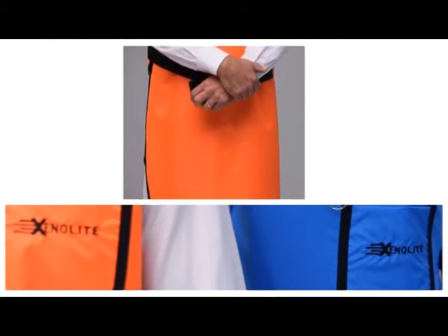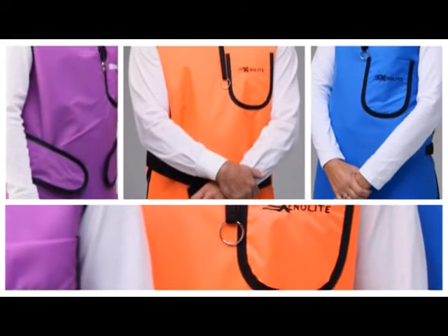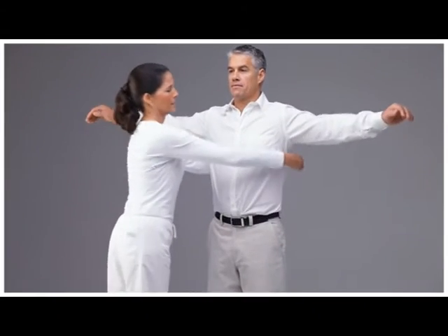Xenolite garments come in a wide range of sizes and a few quick measurements will ensure a proper fit. All that is needed is a cloth measuring tape and a second person to take the measurements.